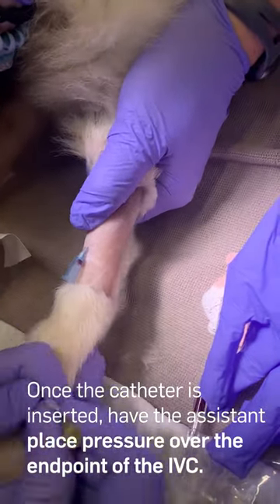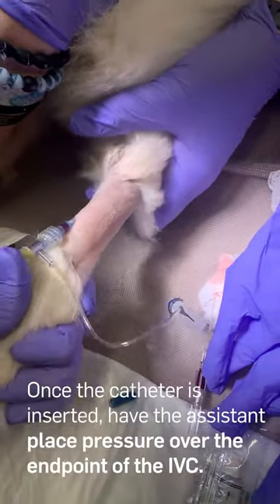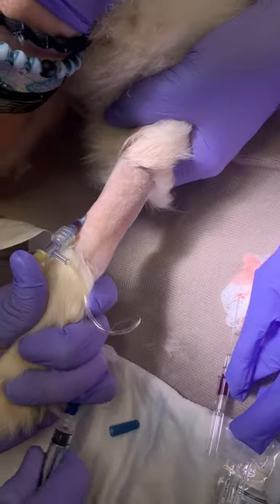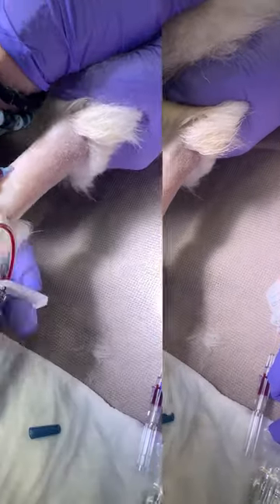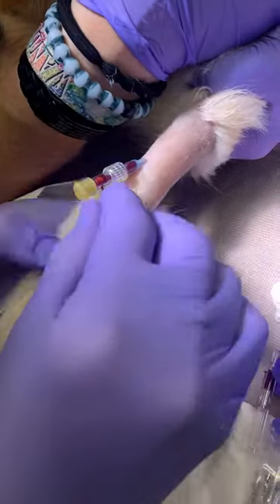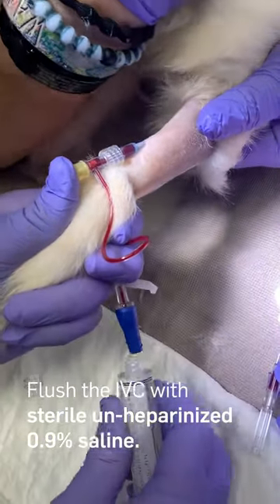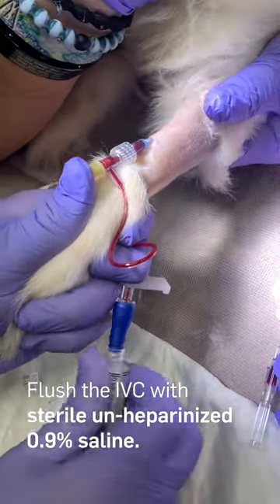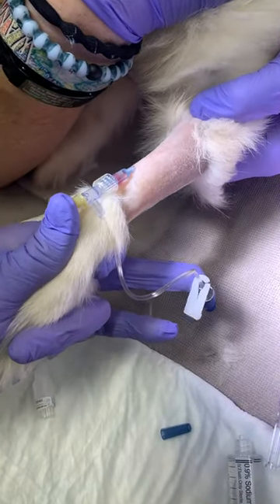Once the catheter is inserted into the vessel, have the assistant place pressure over the endpoint of the IVC, avoiding the aseptically prepped point of insertion. This will help prevent blood from exiting the IVC onto the surrounding area, leading to site contamination. Flush the IVC with sterile heparinized 0.9% saline, having an assistant feel for patency near the elbow joint.